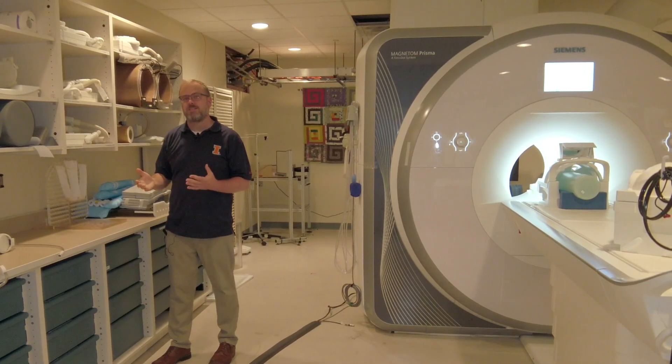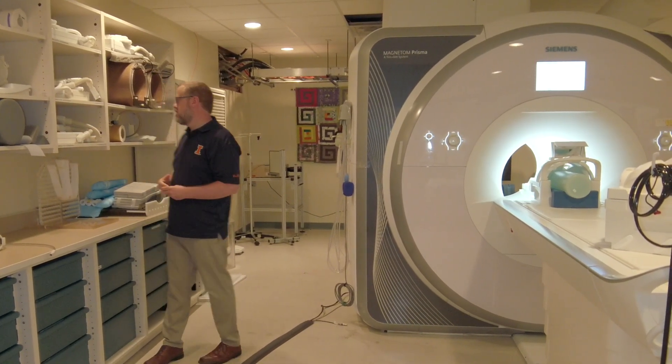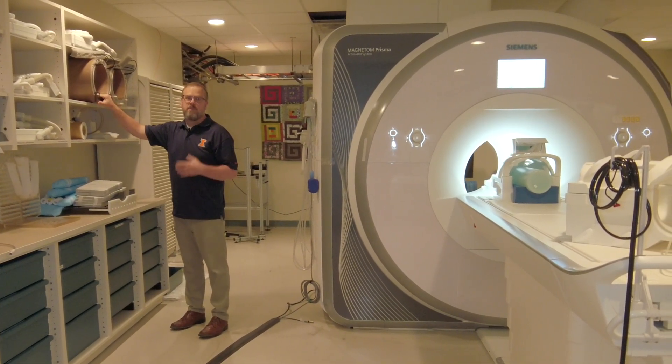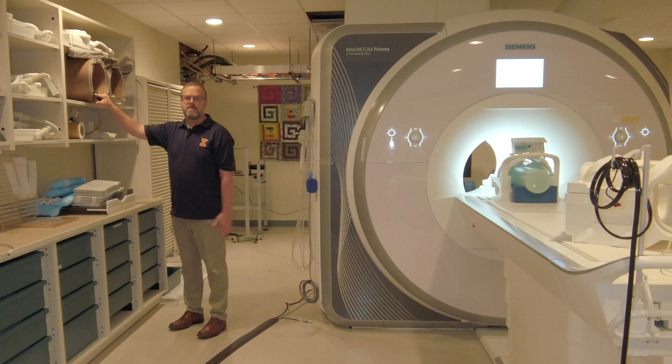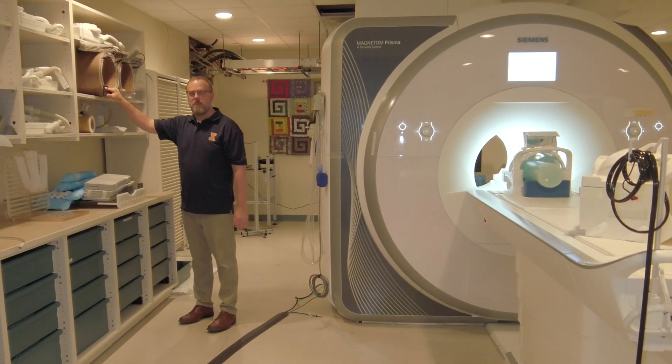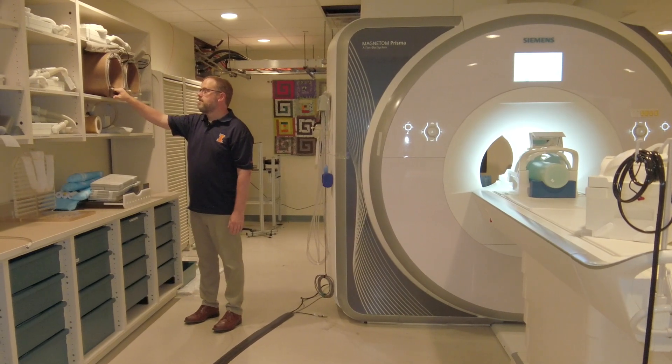You can also see things like pH, so you could see the acidity of different tissues. We also have sodium — 23Na. Sodium is really important for neural tissues. Sodium and potassium are the two chemicals that really create the membrane potentials, so sodium is really important.